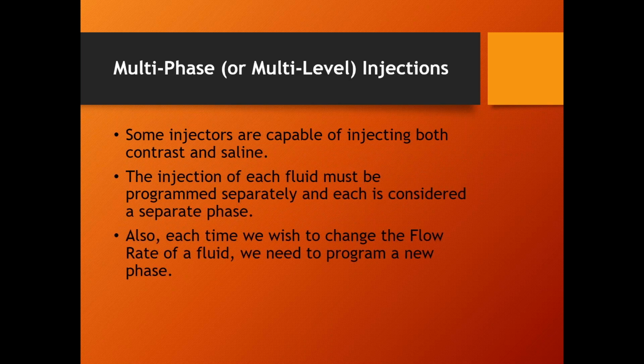A multi-phase or multi-level injection, that's what I demonstrated when I showed phase 1 and phase 2, and they can go up to 4 or 6 or 8 phases. The term multi-level comes from one company, MedRad, the big company. For one of their machines, they don't call them phases, they call them levels. But it's the most common injector out there, so we have to throw that in. But that was what I demonstrated earlier.